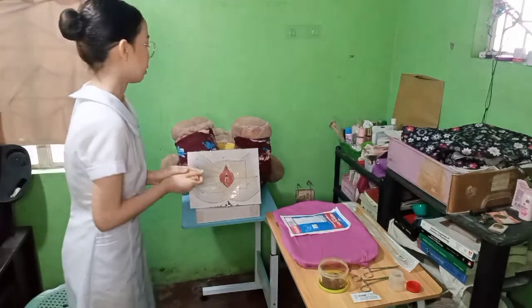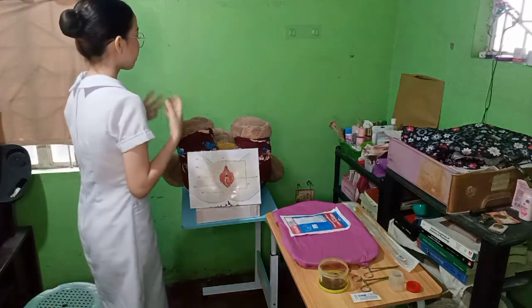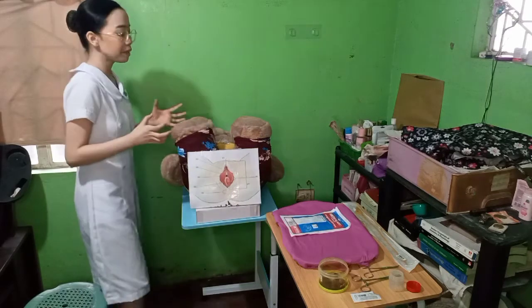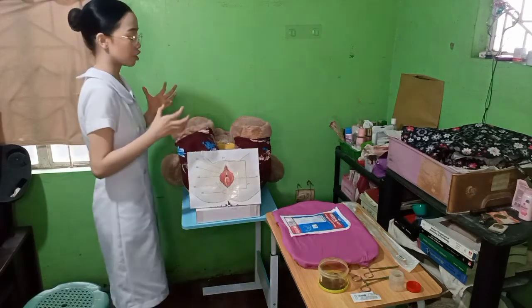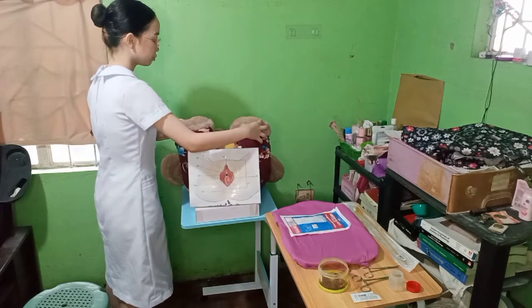And then perform hand hygiene. You can use an alcohol to prevent or to minimize the spread of infection or microorganisms. And to begin the procedure, ma'am, we'll begin the procedure now. So first, place the client in lithotomy position. Ma'am, I will place you in lithotomy position.